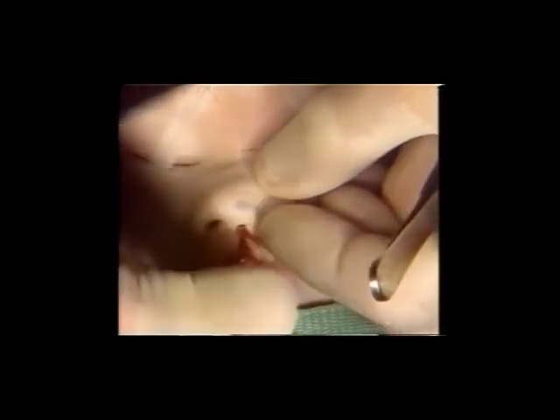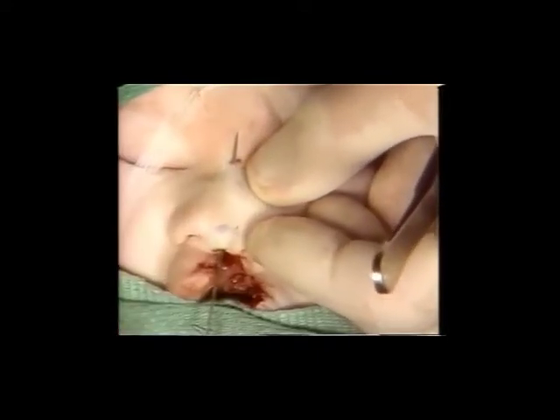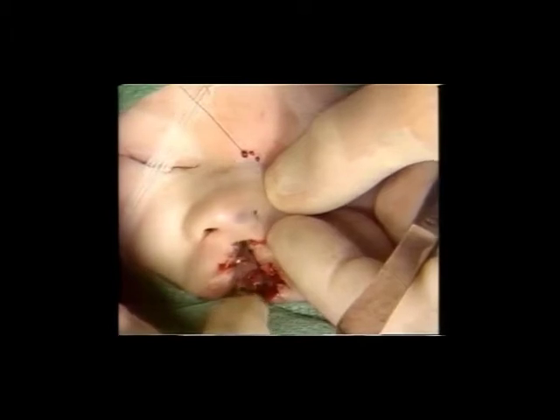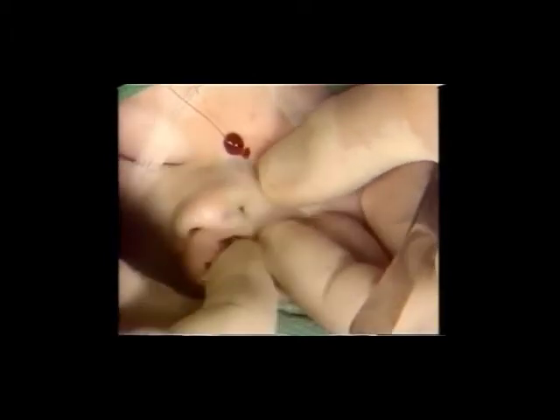A Keith needle is then placed at the nostril apex, brought into this dissection pocket, and then extended up and brought through the area at the nasal radix. A second Keith needle is placed just lateral to this, brought up through the dissection pocket again and extended up to the nasal radix.